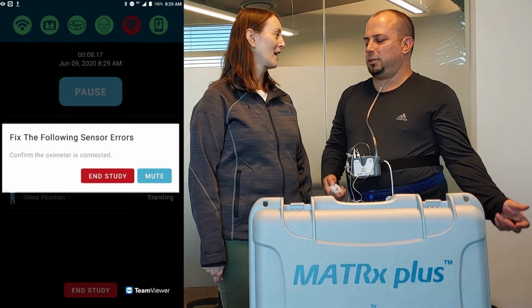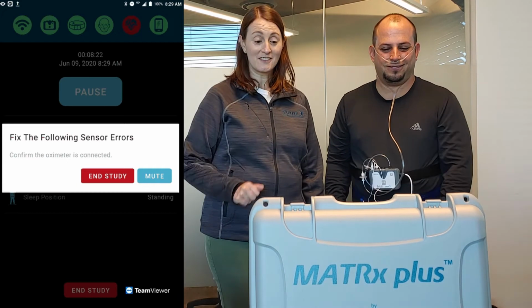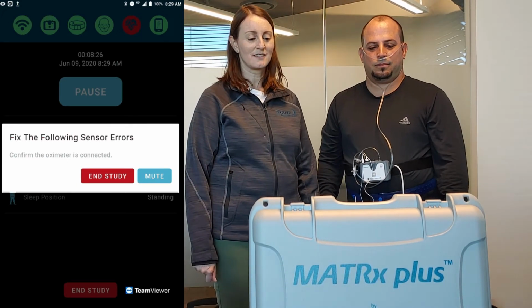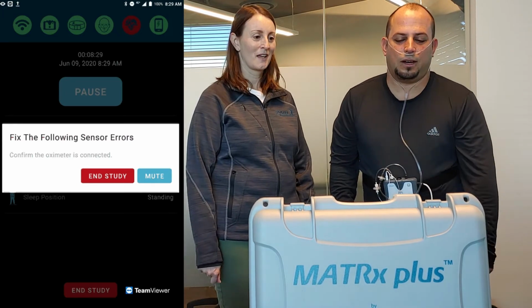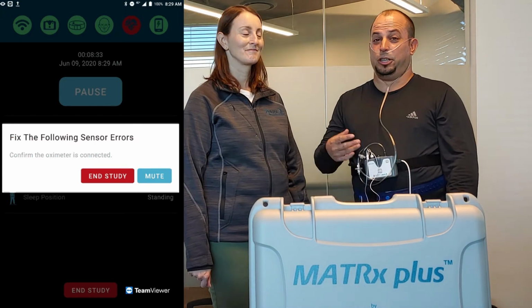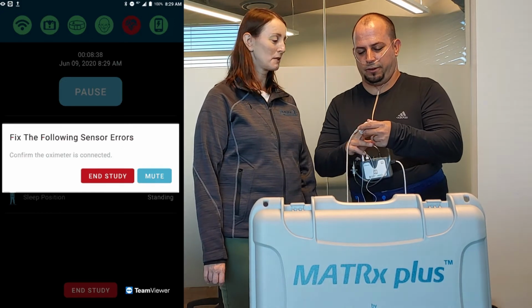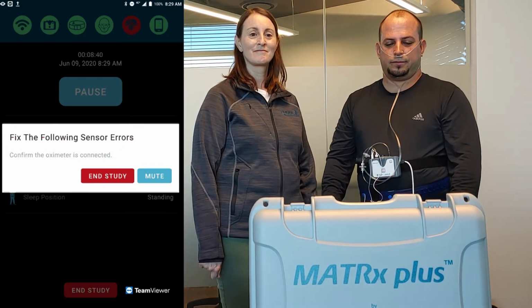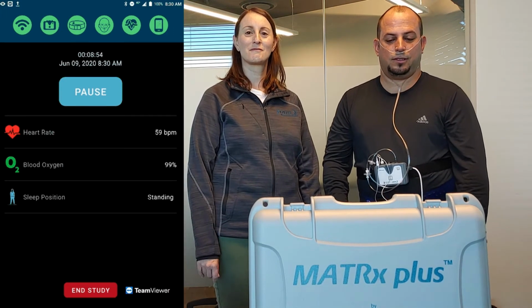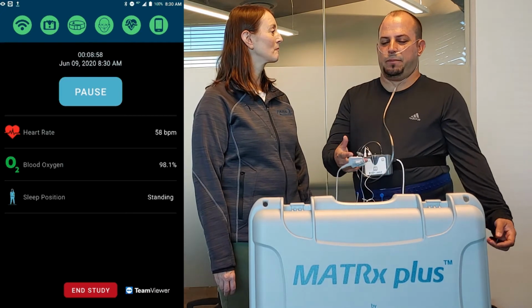What is this? It's waking me up. I'm trying to sleep here. What's going on? It's going to give you an error message, and it's going to tell you, in this case, that the oximeter is not connected. I see, because I do that a lot when I sleep and all of a sudden it just falls off. I should have used tape. That's why we tell you to use tape. So what do I do? Do I just put it back on my finger to fix it? Yes, and once you put it back on, it registers. It'll stop beeping.